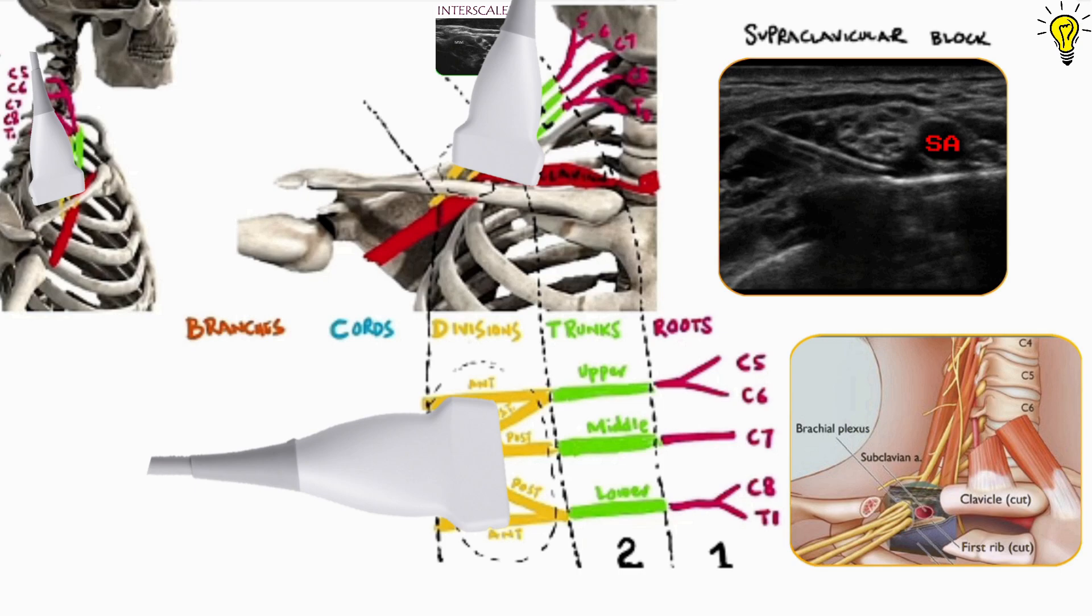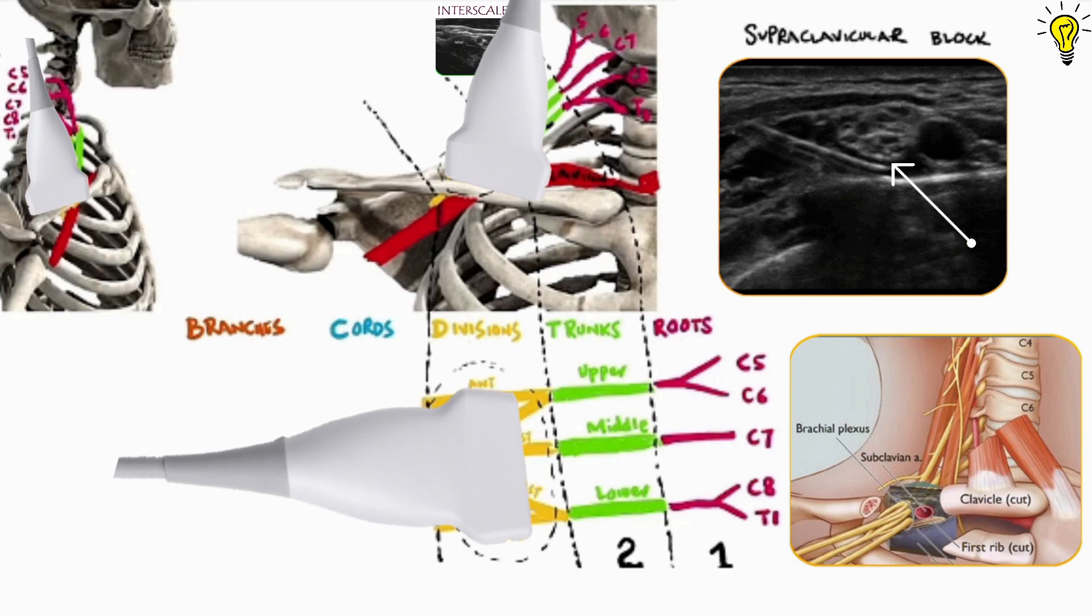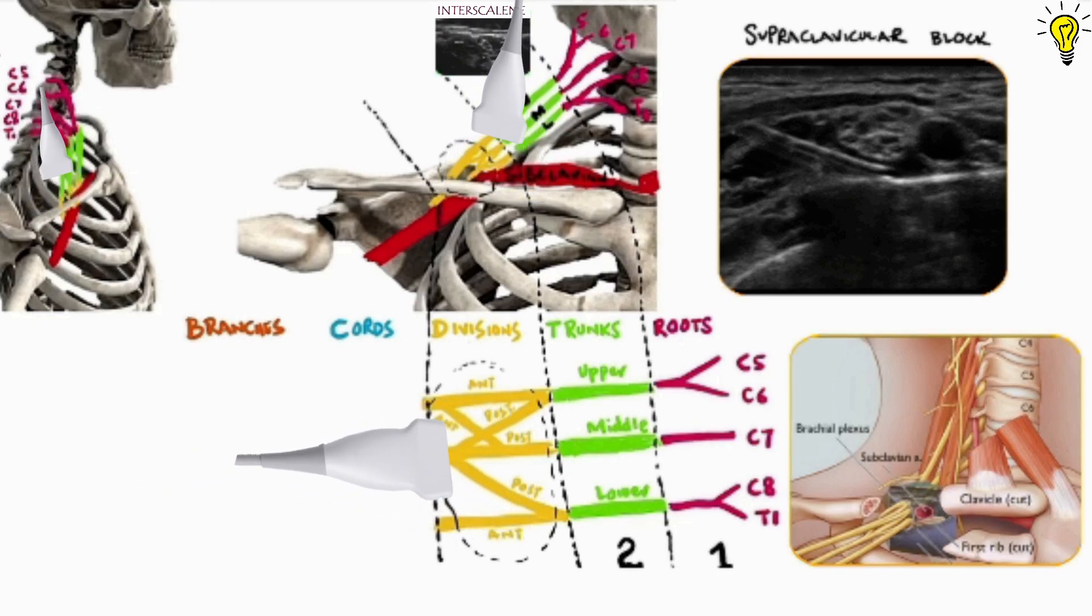Again, a static image with subclavian artery. The grape like divisions lateral to it. And you can also see a needle coming in from lateral side that is targeting the anterior and posterior divisions of the lower trunk. So this completes zone 3 of brachial plexus, the divisions.